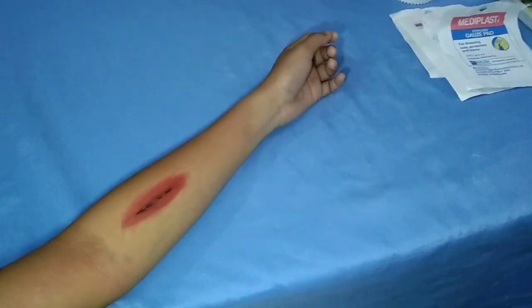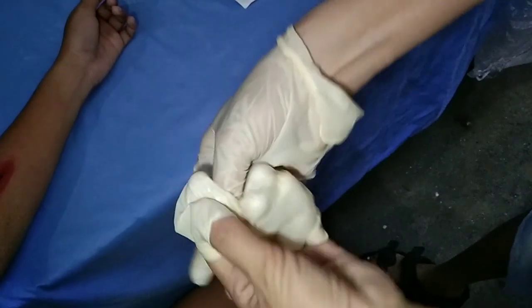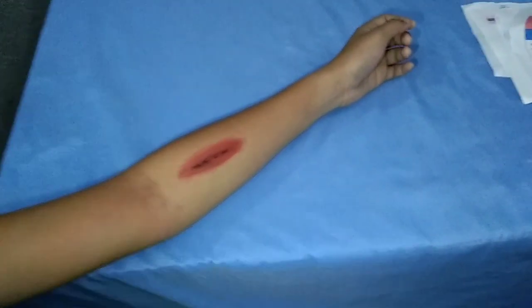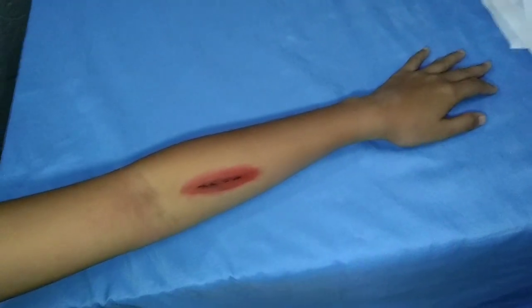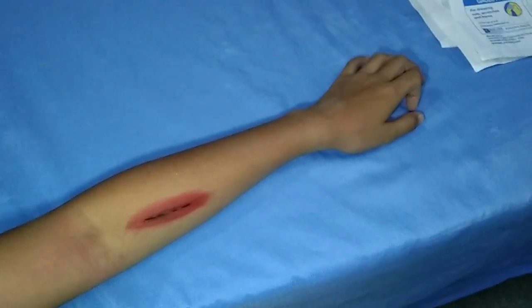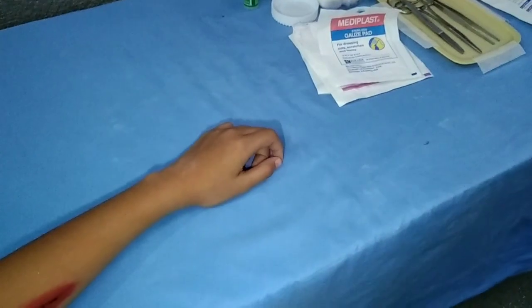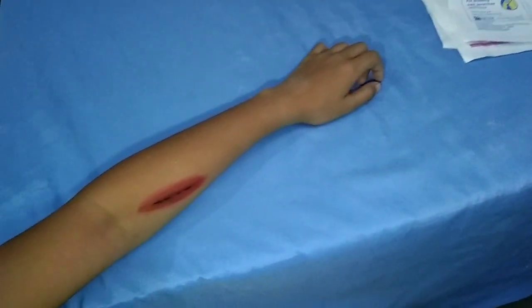Okay, and then after that, remove the clean gloves and dispose of them. Next is open the sterile dressing set using sterile technique. And next is assess the wound. Put on sterile gloves.